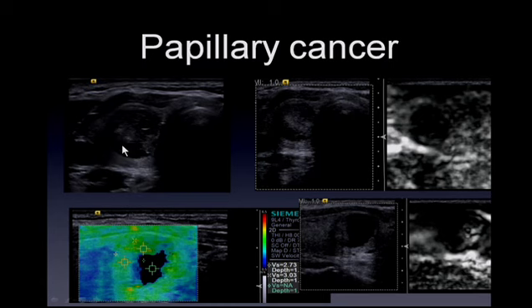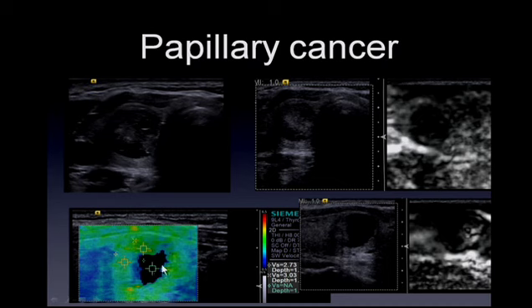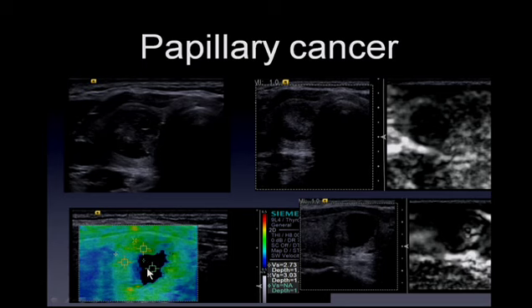This papillary cancer is a hypoechoic, heterogeneous lesion with some calcifications. It is very hard on strain imaging. On the cystic area of the lesion it appears very soft because it is fluid. We feel difficulty in distinguishing benign from malignant based on strain alone without doing indexes. On shear wave imaging, velocities are approximately 3 meters per second, suggesting the lesion is most likely benign. In fluid areas, shear waves do not propagate, so those regions are coded as black.